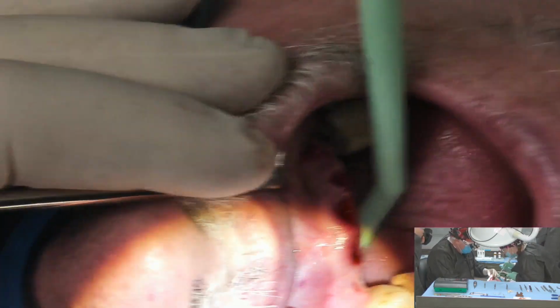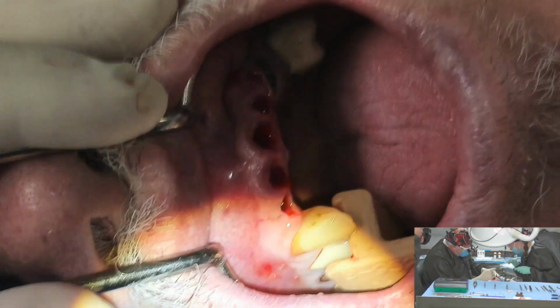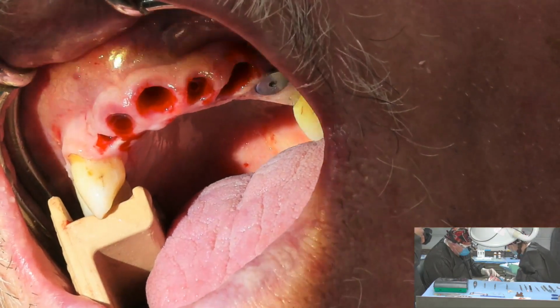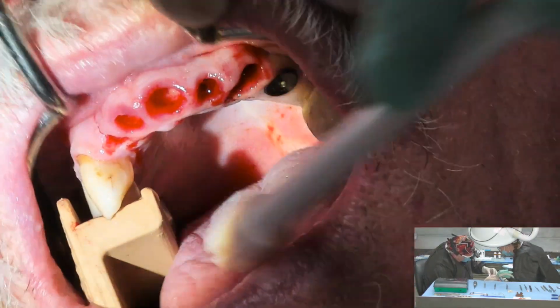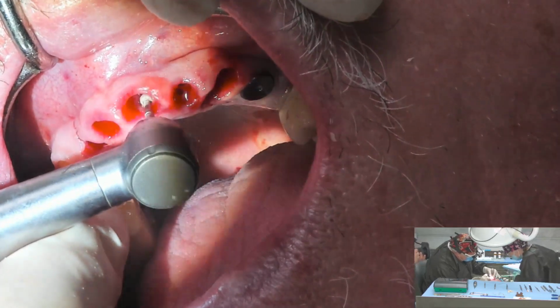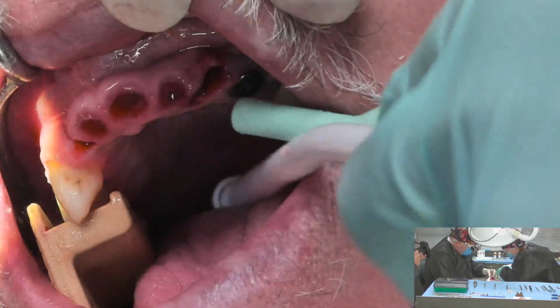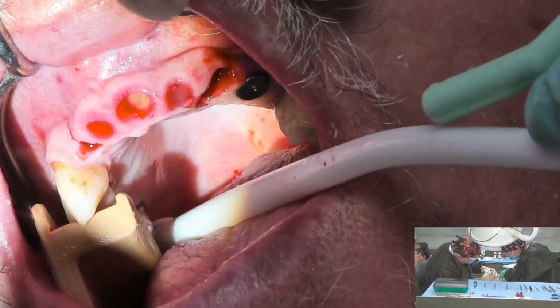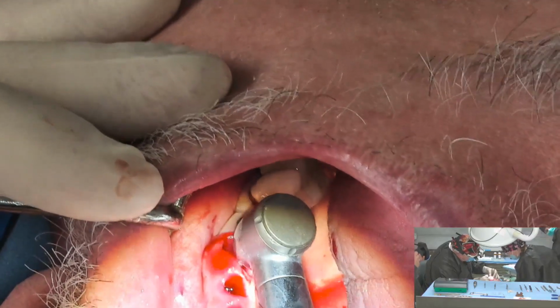So as you can see from my elevation, just a little bit of a crease in the tissue, which is fine. Let me have the small suction tip. And I'm going to stay in the aesthetic zone. We want to stay more to the palatal aspect of the extraction socket and shelf anyway, because we want that emergence profile on the facial. So what I'm doing is just notching my initial passes in the bone, just so we can start our drill access.